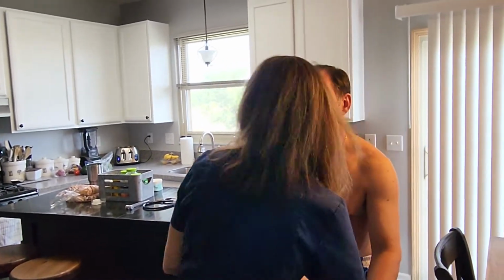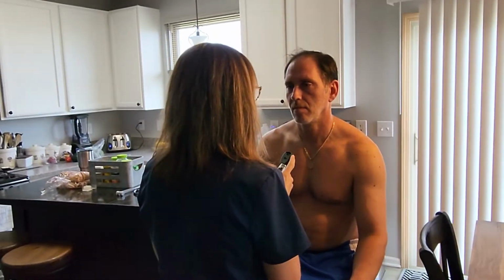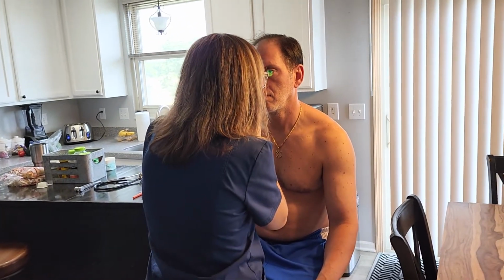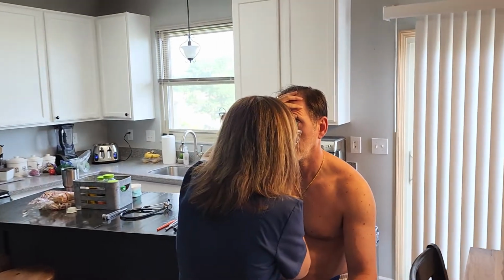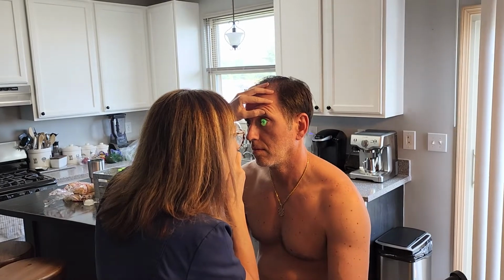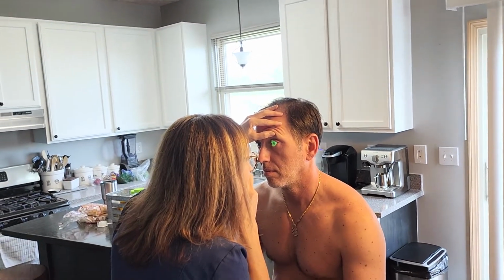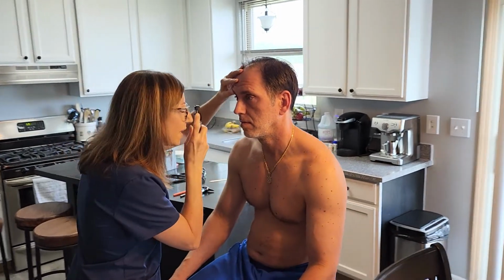And now I'm going to look with my ophthalmoscope and check for the red reflex and the internal structures of the eye. Okay, just looking at your eye here. I want to make sure I'm holding his head still. Like that. Okay. Very good. And then look at this side.